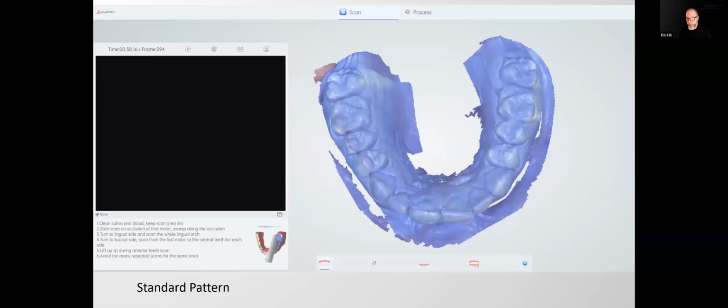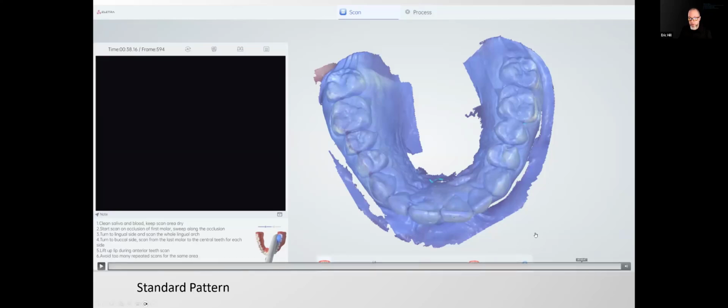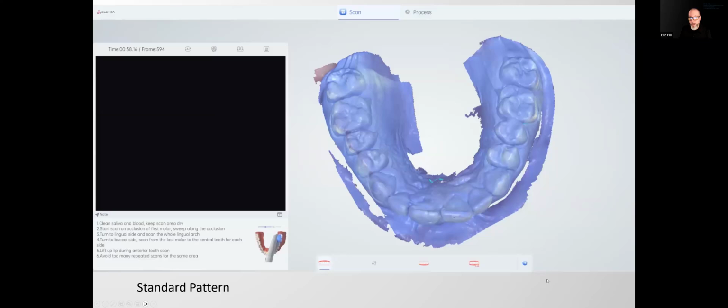So of course, when you're doing this, if you have those little boxes or discolorations that are signifying whether the AI is going to fill it in or not, if they're in a margin, of course, or a contact, please go back in and fill that in, because that's going to be the most accurate. You can use AI to fill in those areas in some circumstances, but I would recommend not doing that, especially in important areas.